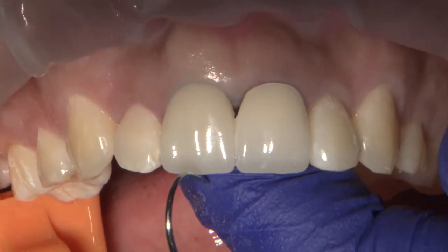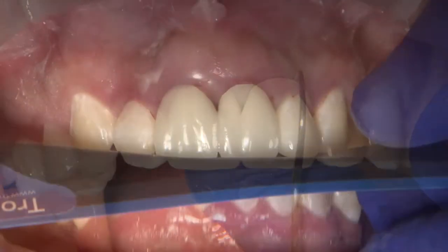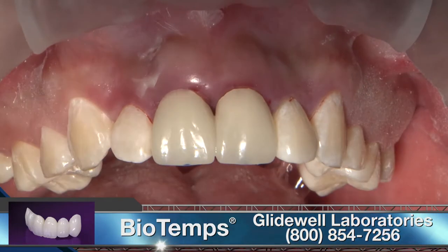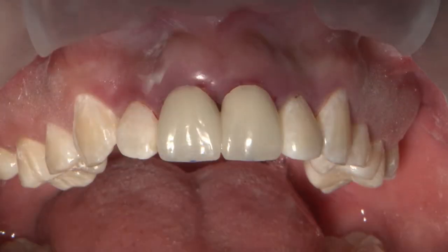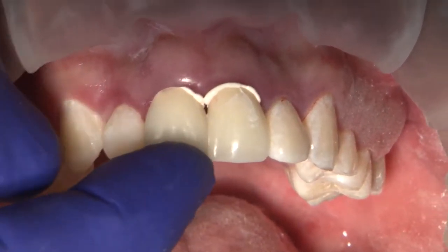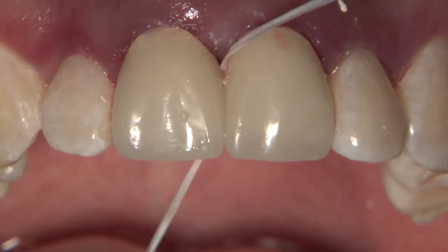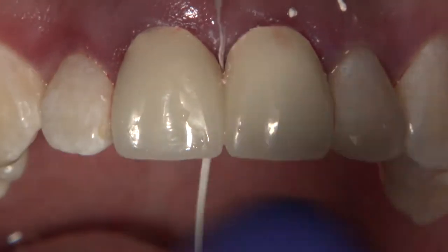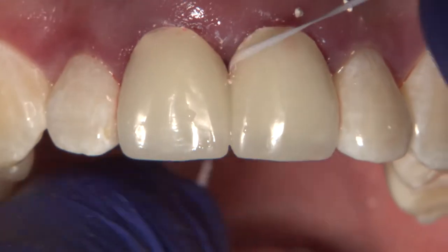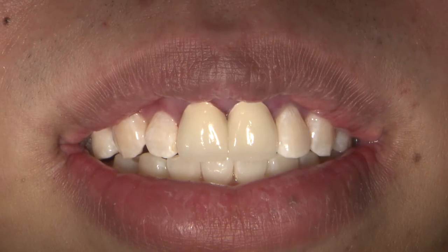With his first set of temporaries, the patient had the chance to evaluate his smile and give feedback, so at the following appointment, he asked if the size and inclination of the laterals could be changed. A new treatment plan was discussed, and the patient agreed to also have veneers placed on 7 and 10, along with the original crowns for 8 and 9. To enhance the aesthetic appearance of the final restorations, I also planned to perform laser gingivectomy on number 7 and bleaching of 8 and 9 preparations due to their dark stump shades.